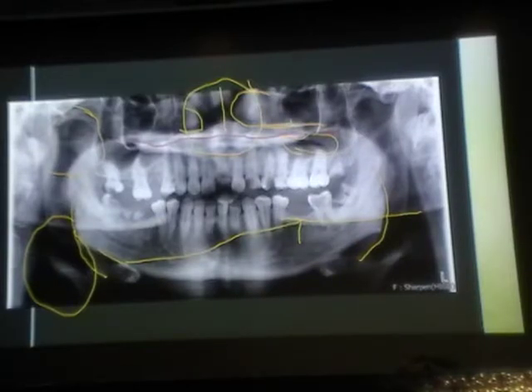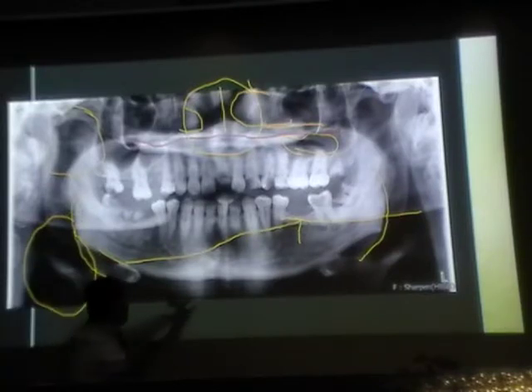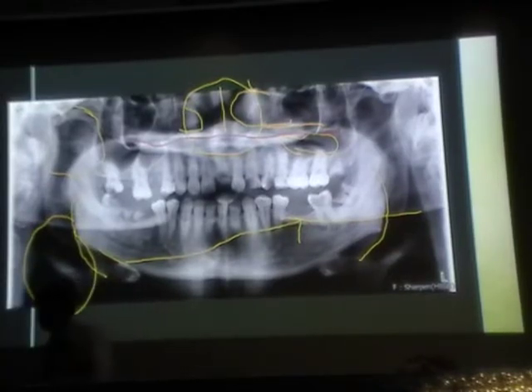Which one? This one? What do you see in the center? Supporting the neck. Starts with cervical and ends with vertebrae, right? Cervical vertebrae. That's the shadow of that one. That's what you're seeing.